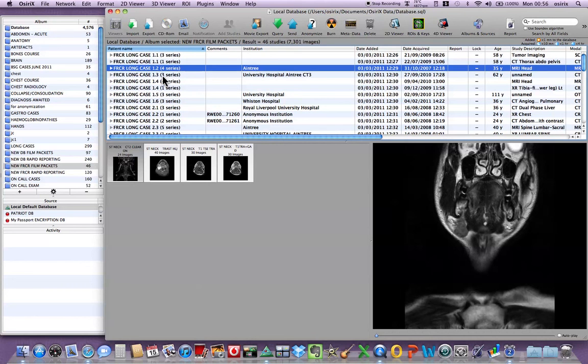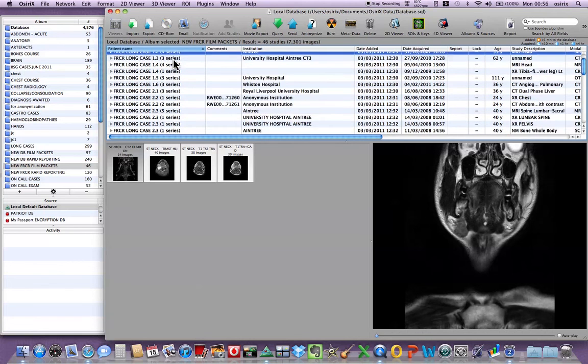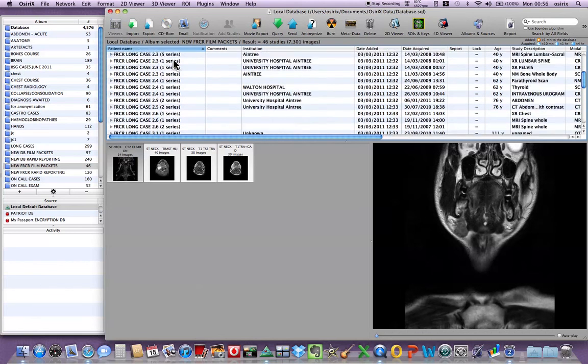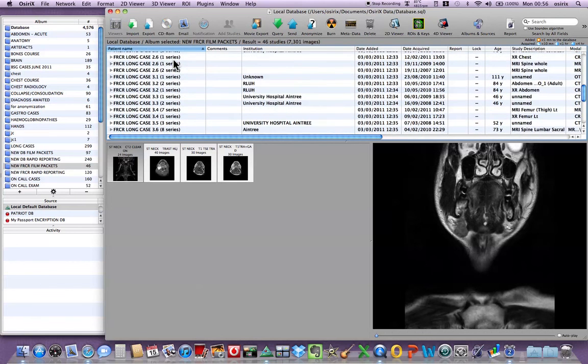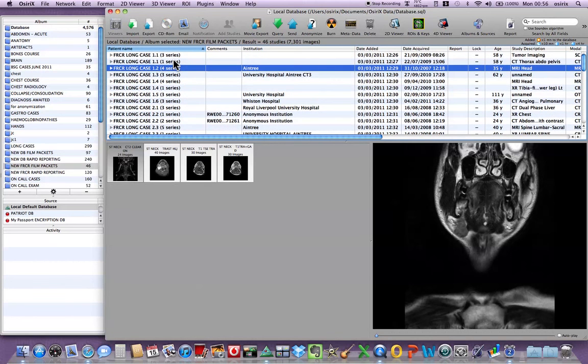There's no substitute for getting stuck into this yourself by acquiring a Mac either for yourself or from somebody else. Load it with OsiriX which is free from the internet using DICOM images and navigating your way around the patient's films. Good luck in the exam. Good luck with OsiriX. And that's the end of the tutorial. Thank you.